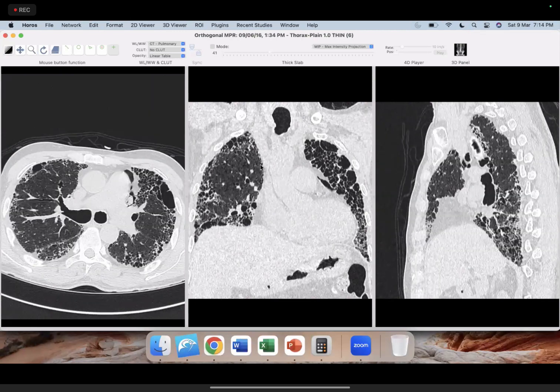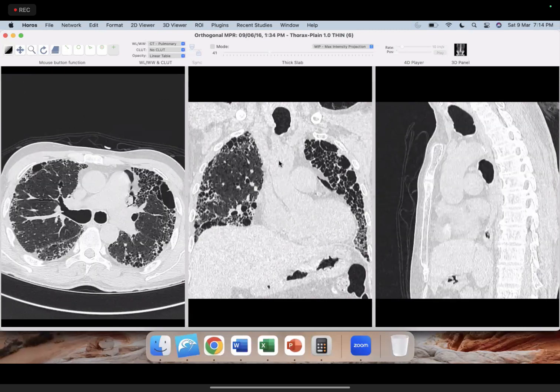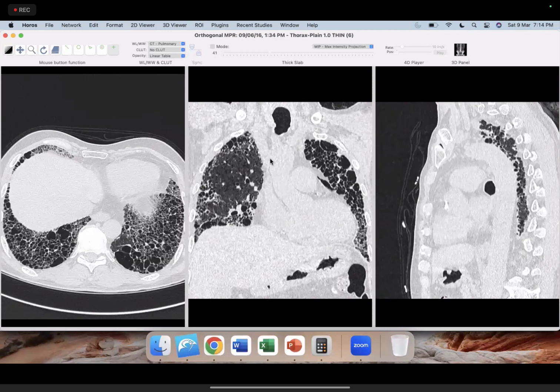And remember, there will be clinical concordance with it. If you ask the history, the patient will say that there has been acute exacerbation. He may be symptomatic with cough or fever for longer duration, maybe years, but suddenly in the last few weeks or days, he has started developing more worsening of the symptoms. That way, it will correlate that the ground glass is due to acute exacerbation.